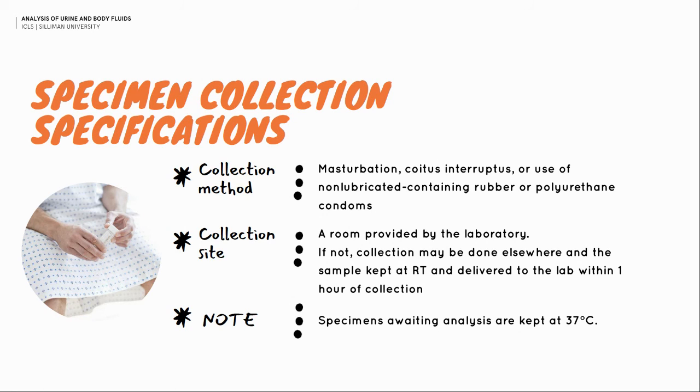And condoms are also not advised because some condoms contain spermicide, which will kill the sperm. Also, we cannot control the number of sperm because some stick to the walls of the condom and cannot be fully collected. So again, it will alter the result you will have after. So that is for the collection method. The most commonly used is masturbation.